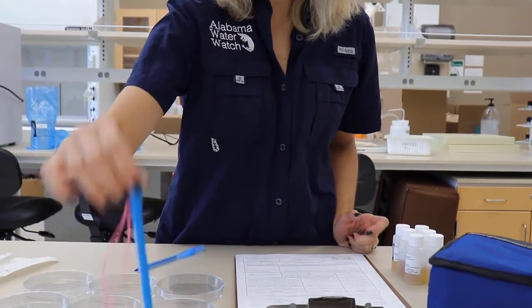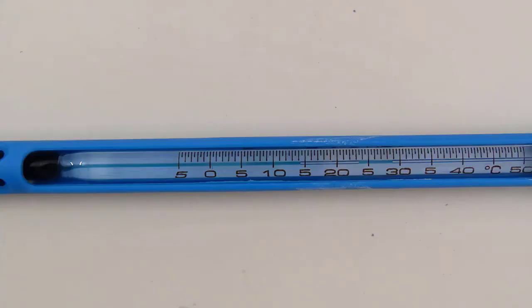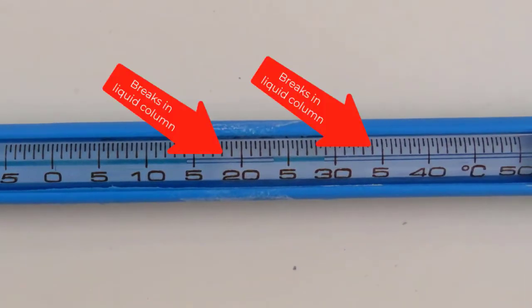You will need a thermometer to check air and water temperature at your site. The thermometers we use are alcohol-based and measured in Celsius. They are the same thermometers found in the Alabama Waterwatch Water Chemistry Monitoring Kit. Make sure to check the thermometer for any breaks in the glass or liquid before heading out to sample. Breaks in the liquid can give you an incorrect temperature reading.